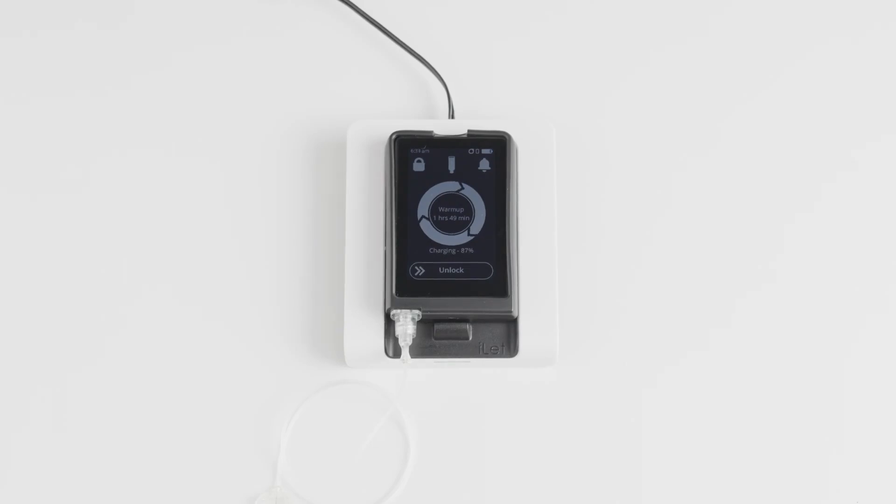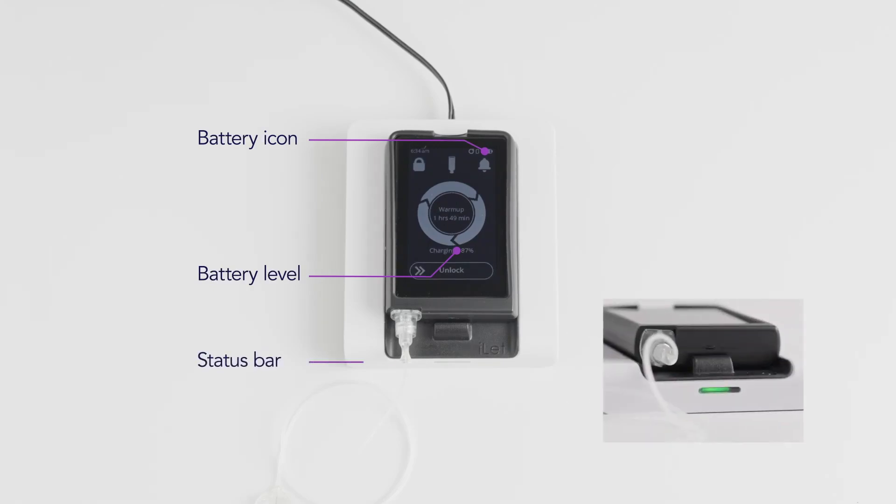There are several ways you can tell that the eyelet is charging. The eyelet will beep. The backlight will illuminate the screen. The screen will indicate the battery level. The battery icon in the status bar will animate. And the status light on the charger will be a solid color.